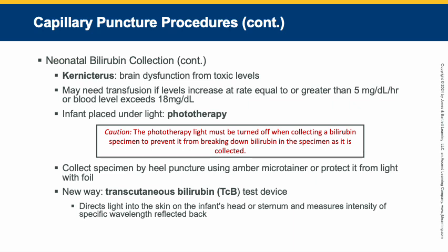This treatment is called phototherapy. Phototherapy lamps emit a light in the blue spectrum, and any damaging UV light is filtered out. They also have phototherapy blankets that break down bilirubin that they can also use.